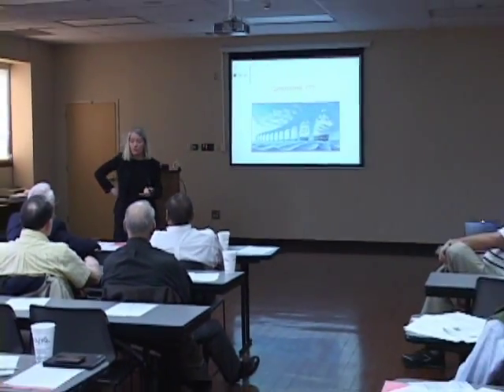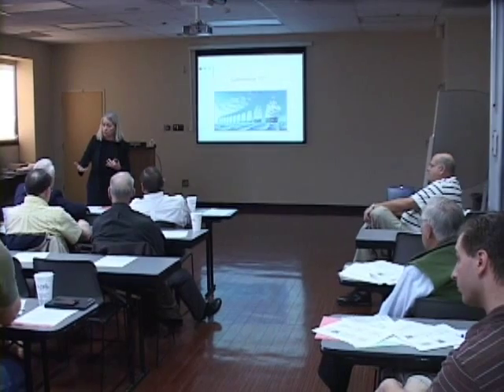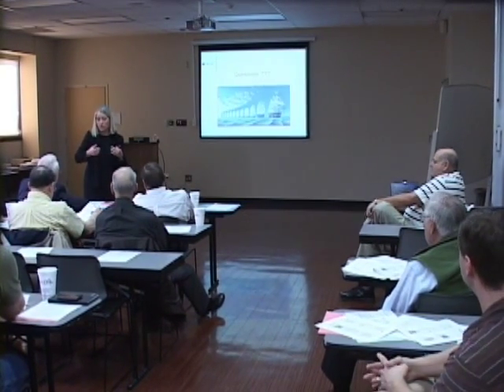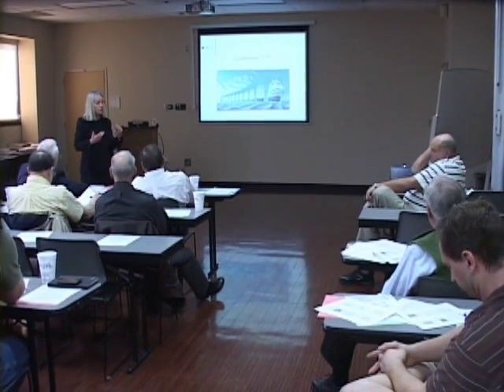Yeah, sometimes if you're working with a very low mA system too, and you've got a thick patient, they're absorbing the radiation. So your only option is to increase your kVp to try to get more of the photons, but that's going to affect your contrast. You're going to get a grayer shade of contrast.